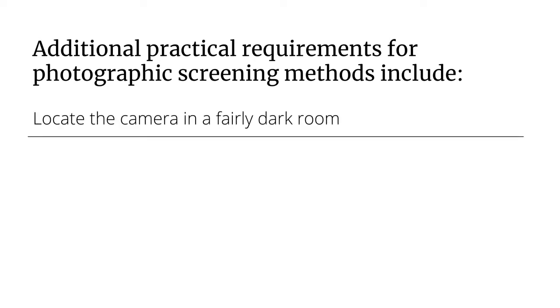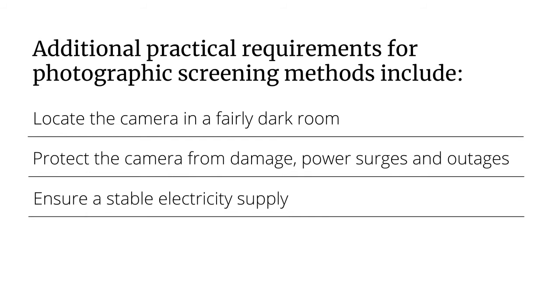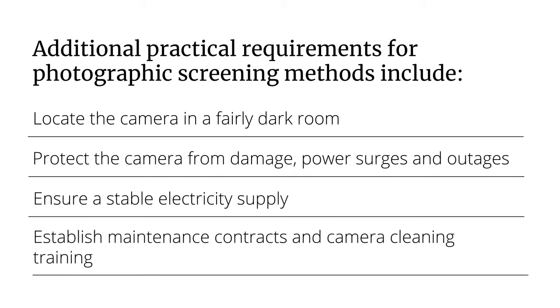Additional practical requirements for photographic screening methods include locating the camera in a fairly dark room, especially for non-mydriatic cameras, protecting the camera from damage, power surges and outages, ensuring it has a stable electricity supply, and establishing maintenance contracts and training for cleaning the camera.